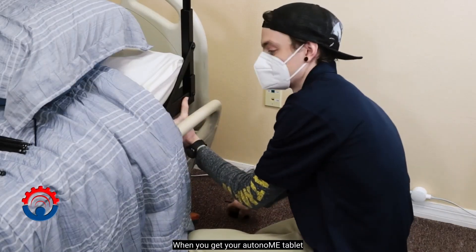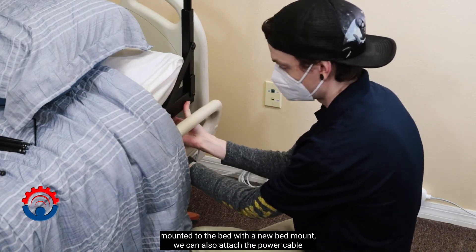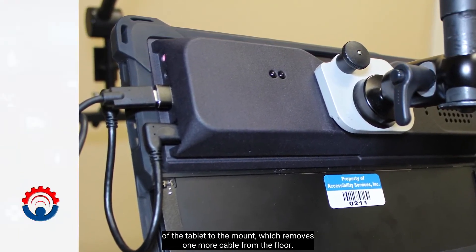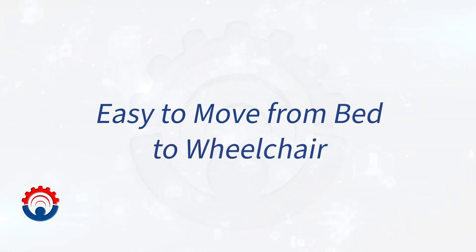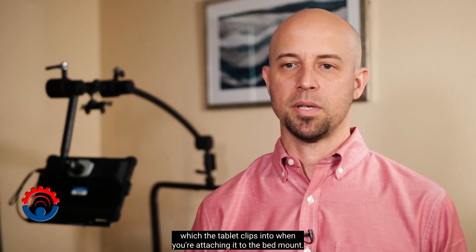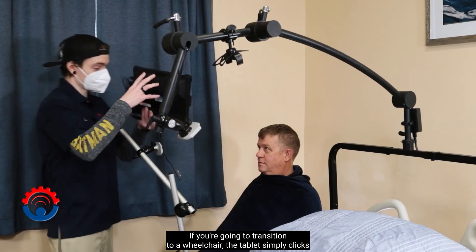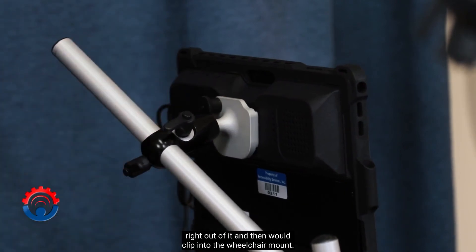When you get your autonomy tablet mounted to the bed with the new bed mount, we can also attach the power cable of the tablet to the mount, which removes one more cable from the floor. We have a simple receiver mechanism which the tablet clips into when attaching it to the bed mount. If you're going to transition to a wheelchair, the tablet simply clicks right out and then clips into the wheelchair mount.